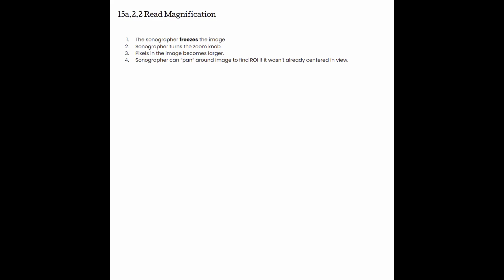The other one then is read magnification. With read magnification, which is also known as read zoom, this is going to happen once the image is frozen. So now this makes it a post-processing function. Looking at these steps then, we can see how the sonographer can use read zoom. So you're imaging, you're going to freeze your image with the freeze button.